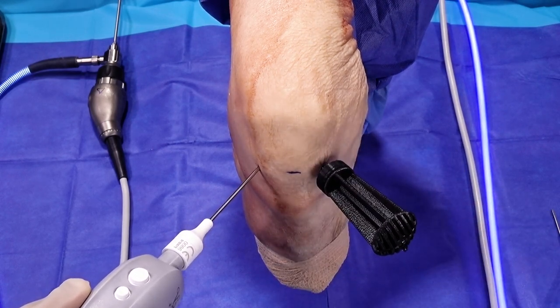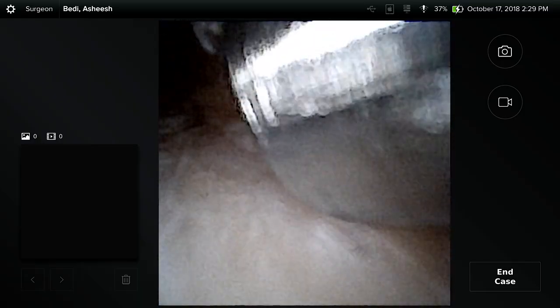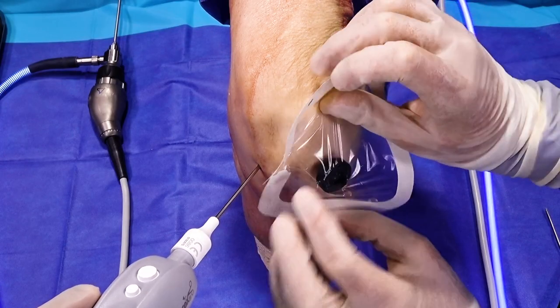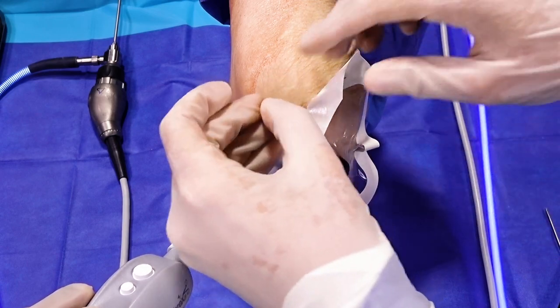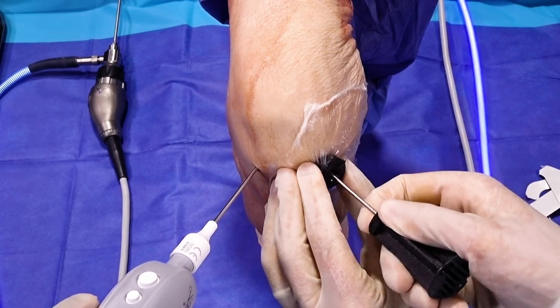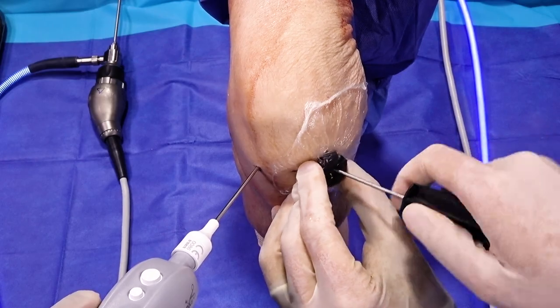The wire comes out and our working cannula is in position. We remove the obturator and we're in a perfect orientation to instrument the joint, triangulated right to the lateral meniscus. We have the custom Tegaderm that holds the cannula in position — smooth to minimally traumatize the soft tissues — so as we slide instruments in and out there's no concern about the cannula coming out of place. With this reverse trampoline effect I can still pull the cannula back and forth to adjust my working length while maintaining it in position.